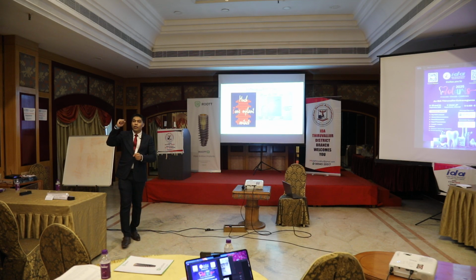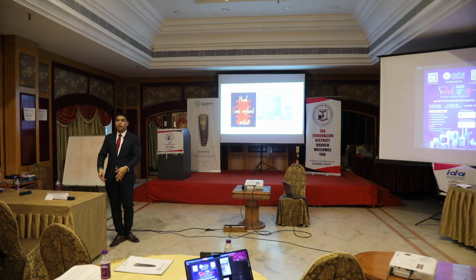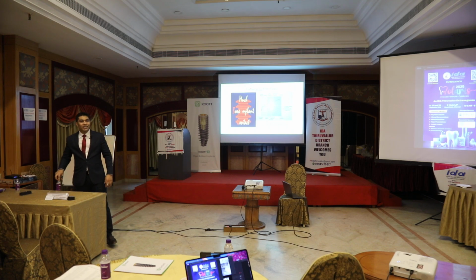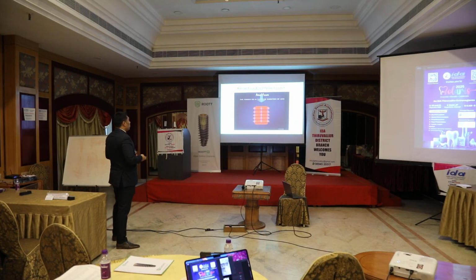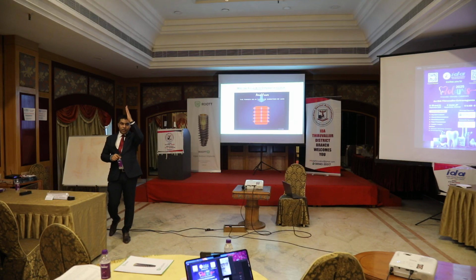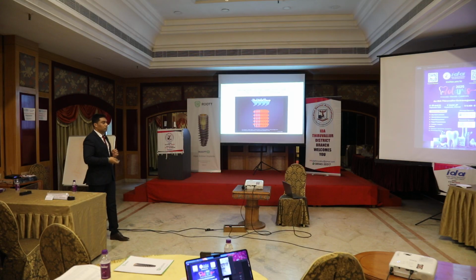This happens when you're using a very narrow implant on a very wide prosthesis. If you're using an implant of 3.3 millimeters in a molar region, and the patient comes after 2 years and there is a V-shaped bone loss, and you think, okay, nothing happened for 2 years, why is it happening now? It's because the bone is failing to cope with the stress. So again, when you place an implant exactly according to the load transfer area, there will be minimal failures because the bone is very good at taking compressive forces. The moment you do an off-axis load, there will be pressure and tension planes created.